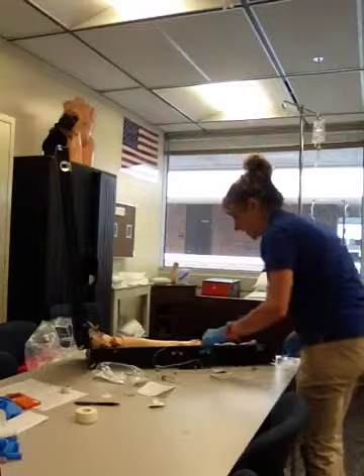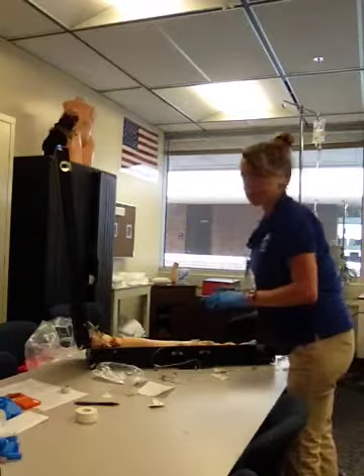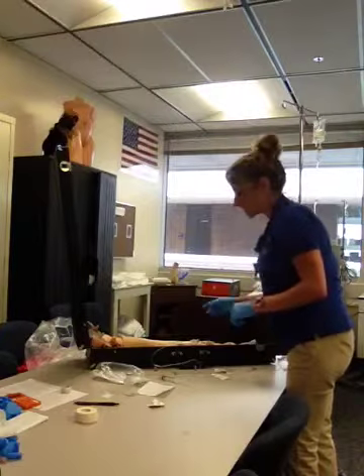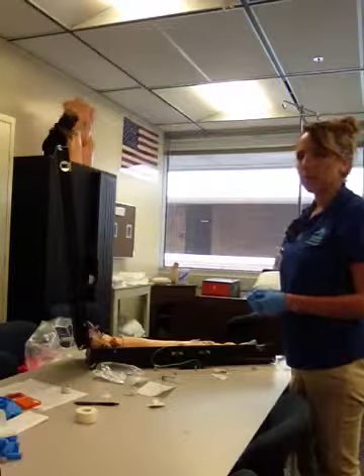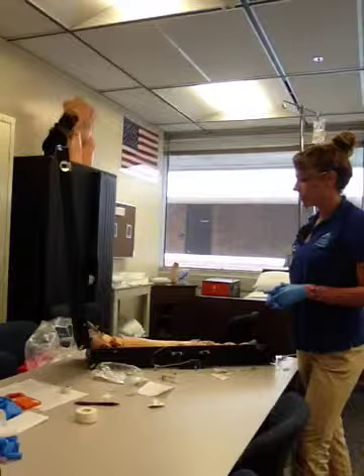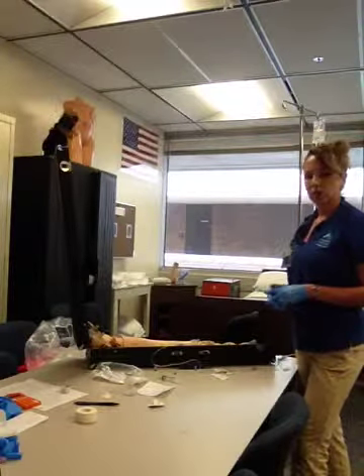Okay, do you have any pain or anything at the site? All right, the patient states that she does not, and I'm going to make sure I don't see any signs of anaphylactic skin rash or any allergy reaction. As nursing implications, we want to keep monitoring the ALT and AST laboratory values. We know that this drug can be ototoxic, so we want to make sure that our patient isn't having any trouble hearing over the course of her drug therapy.